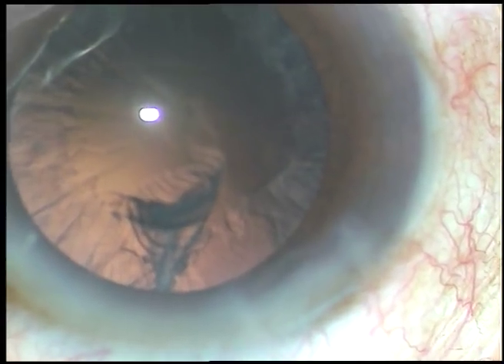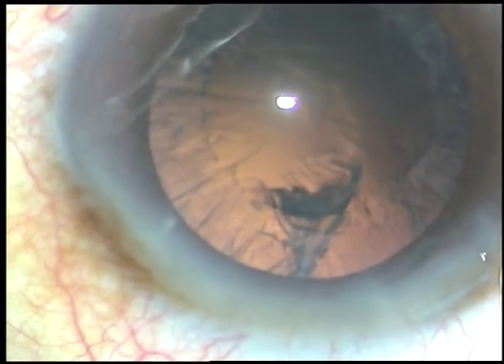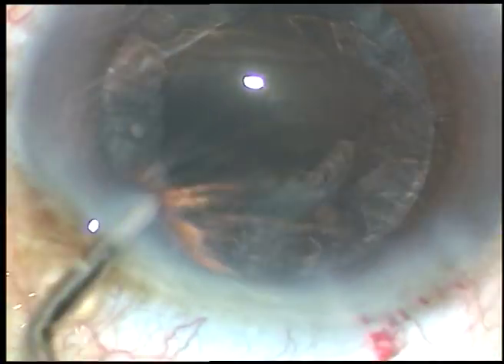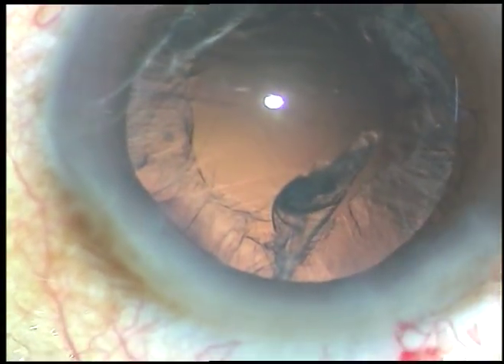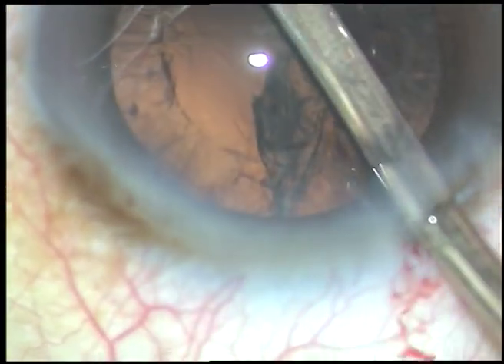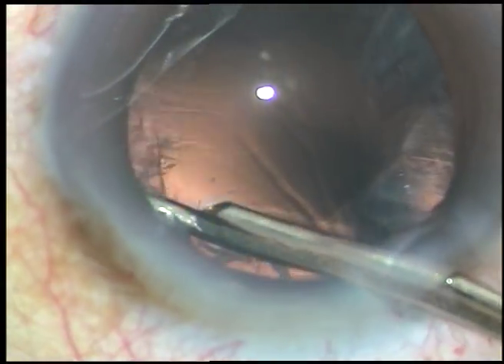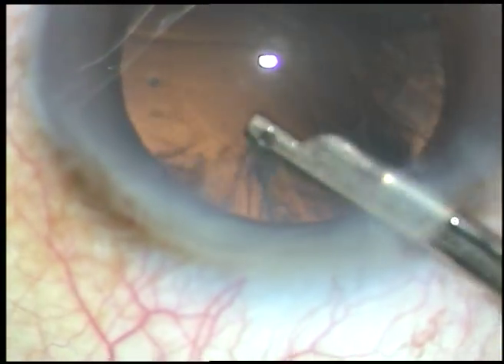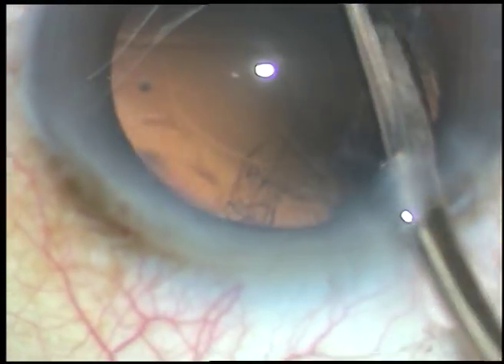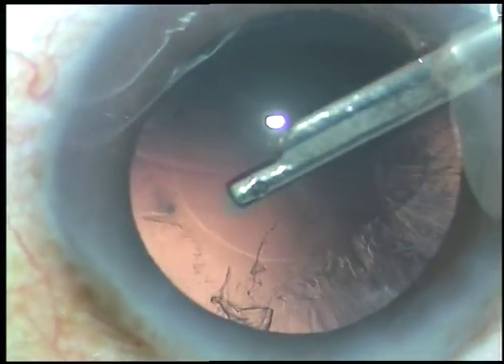The nucleus has been nicely managed. Now, the cortical clean-up has to be done. Many colleagues have expressed doubt why I use Simcoe cannula for cortical clean-up, and their main concern is the size of the side port. Yes, the side port is a little larger — it is about 1.5 or 1.6 mm.